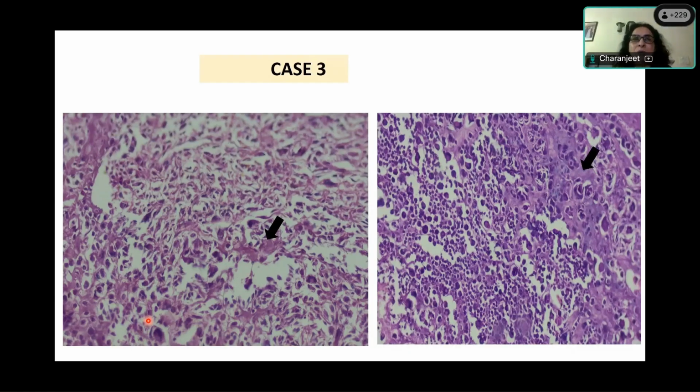Number one, extensive sampling was done in this tumor and there were no phylloid-like areas. Dr. Bigre, what are phylloid-like areas? Can you describe a phylloid-like area? In a phyllodes tumor, what type of areas do you get? We can see the leaf-like pattern. Very good. So you see leaf-like stroma, a leaf-like pattern.